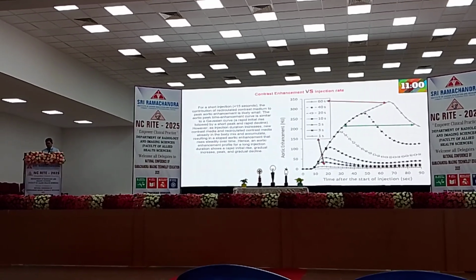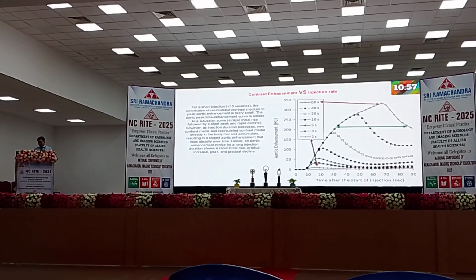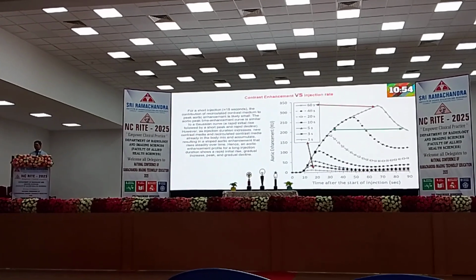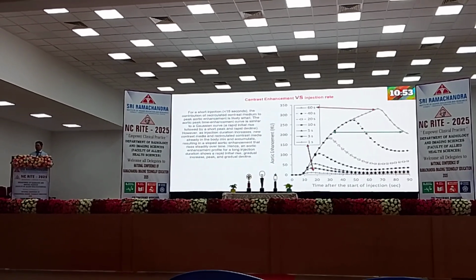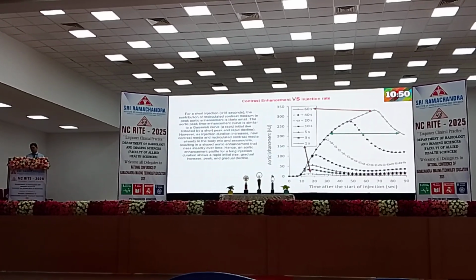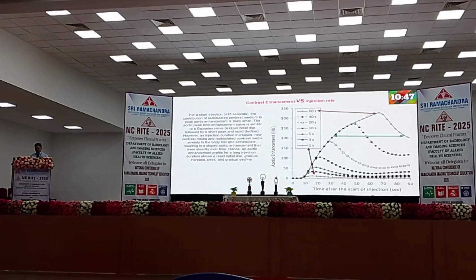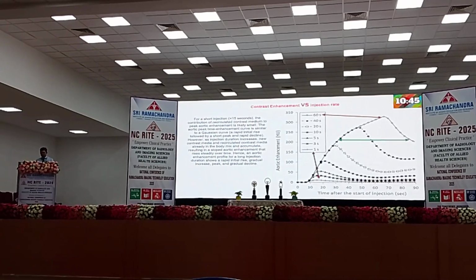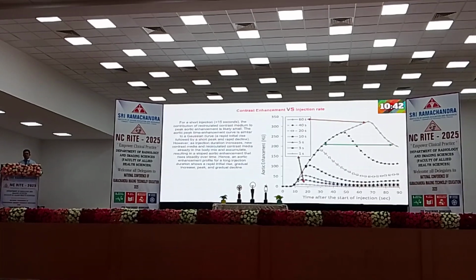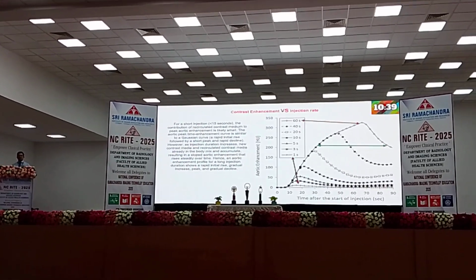you see that. What is the benefit of this? If longer scan durations are there, you should have a longer duration of flow, or contrast injection, supposed to be there. We call it a window period. You can see the green line that is shown here. You have enough window to complete the scan with good enhancement of the contrast.